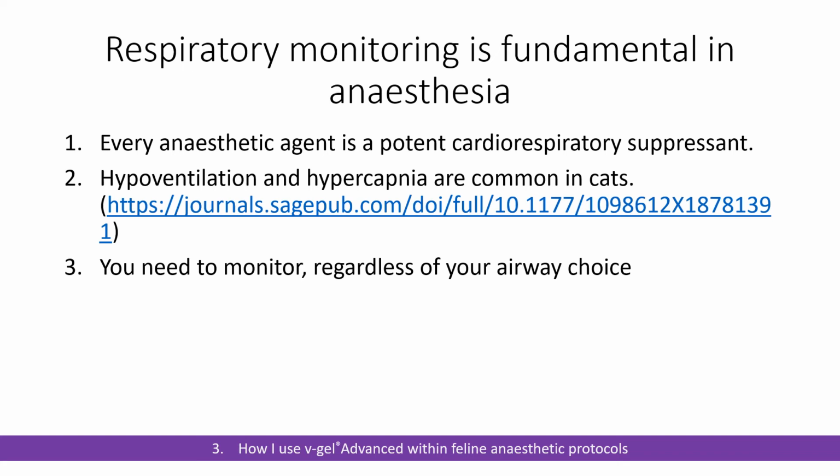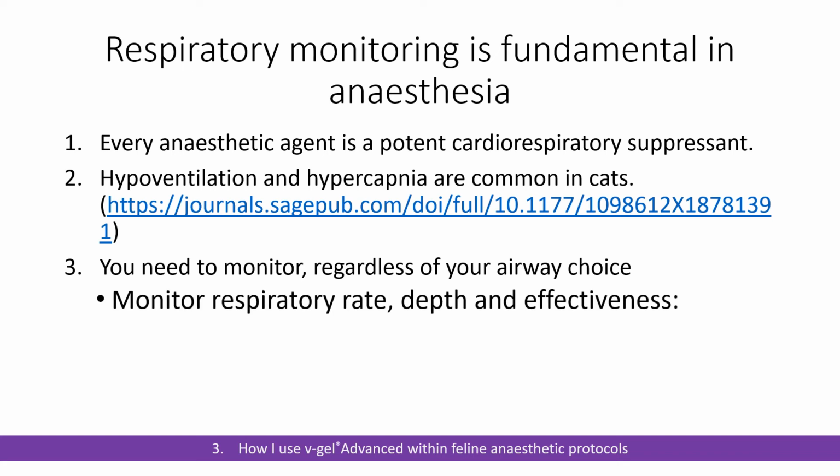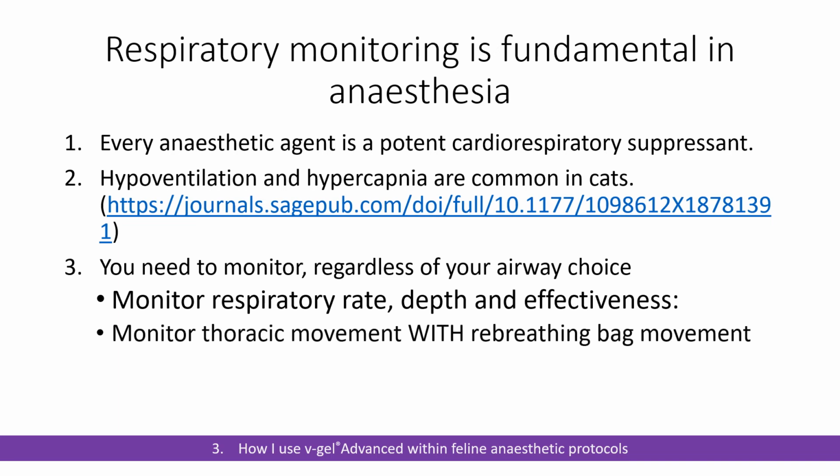Things that I would think about, you want to be monitoring your respiratory rate and depth, which I'm sure we're all doing, but you should also be monitoring your respiratory effectiveness. You can move your chest without exchanging gas. So think about things like monitoring thoracic movement and rebreathing bag movement at the same time. And that's telling you a number of things.